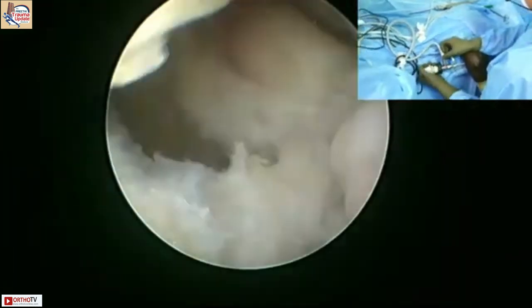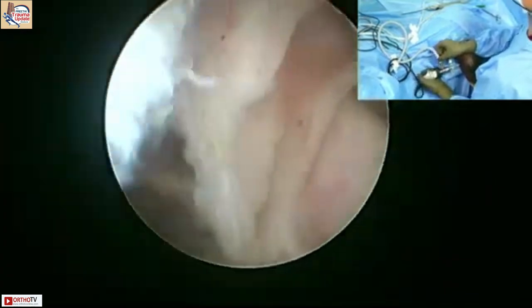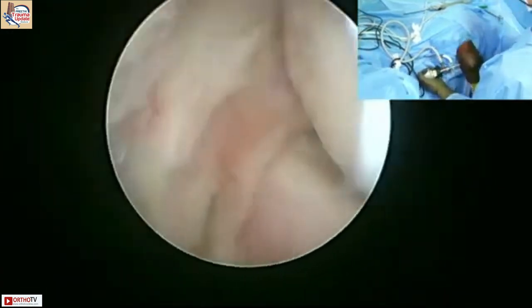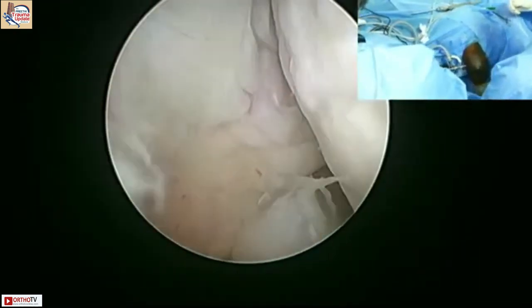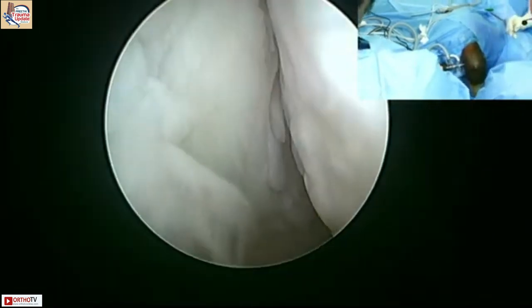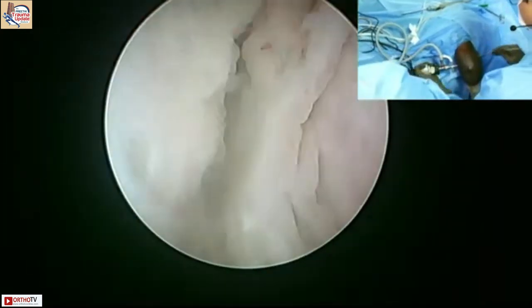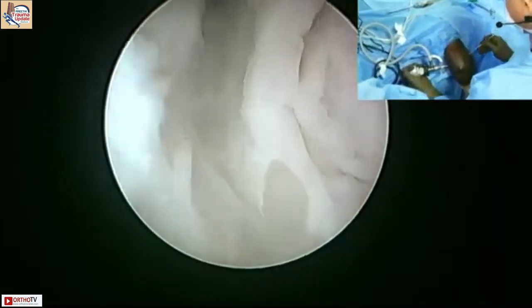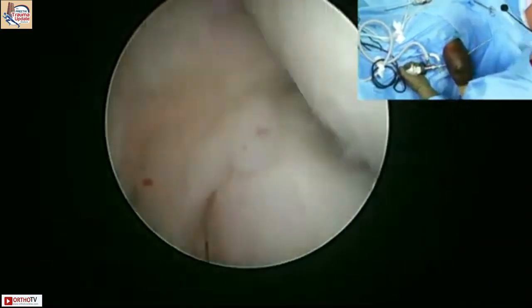Can you show the anatomy of the ECRB? ECRB attachment, yeah. Okay. Can I have the hook, please? So it's where my hook comes in. Okay, so he has, you see that red bit? Yes, if you look at the scan, just hold the hand there. Relax, let me go in. Sir, can you just demonstrate to the audience where you do a tennis elbow release arthroscopy? Yeah, that's what I'm saying. ECRB.